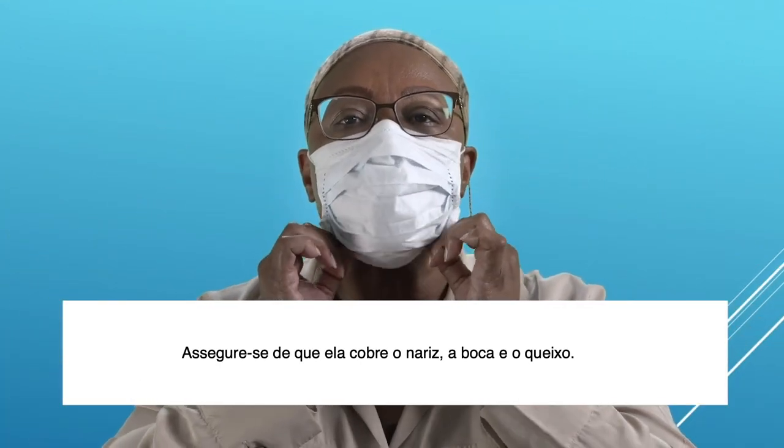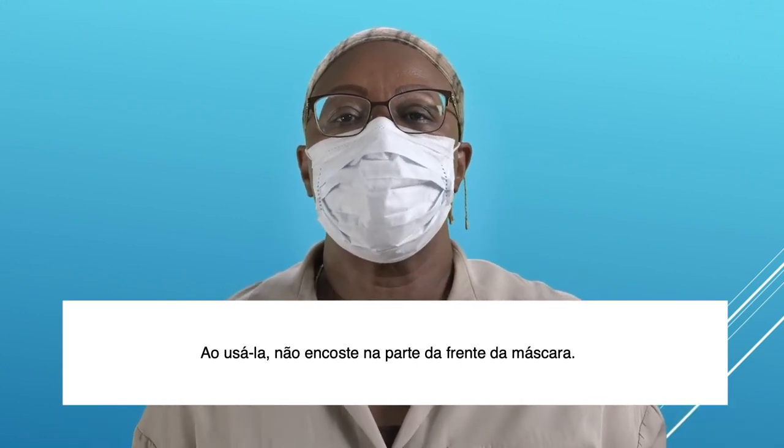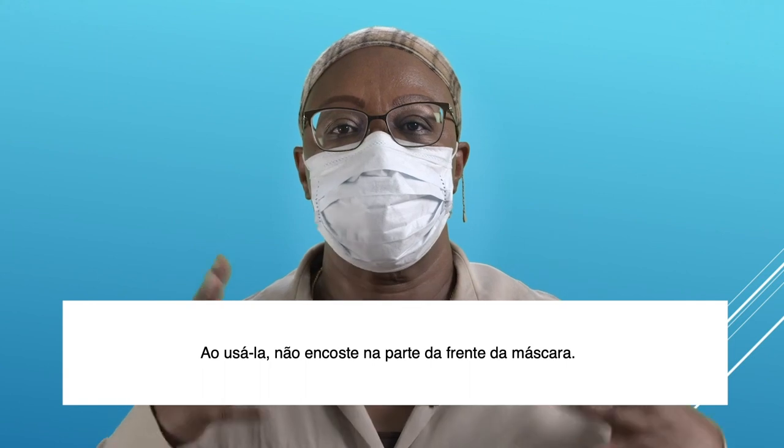Make sure it covers your nose, mouth, and chin. While in use, do not touch the front of your mask.